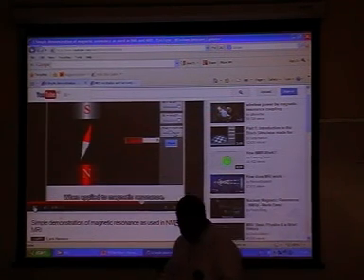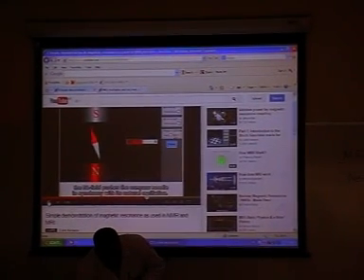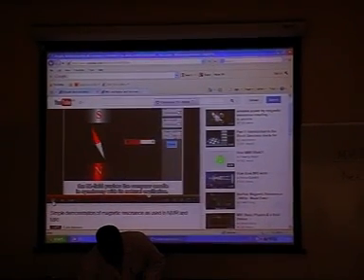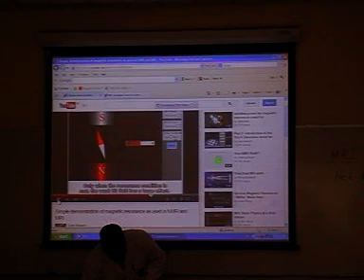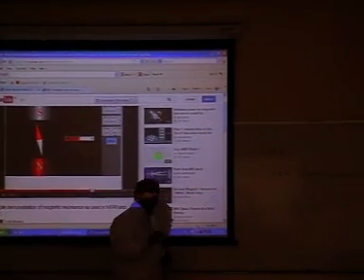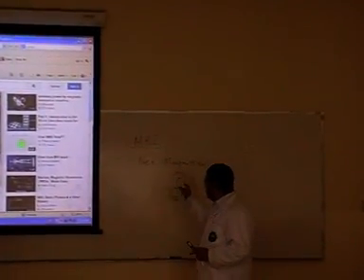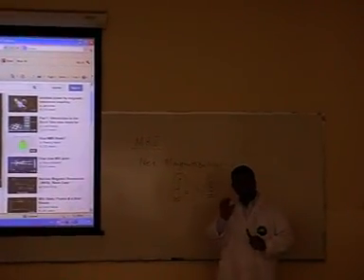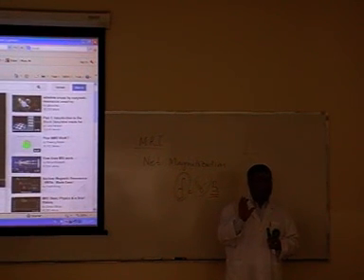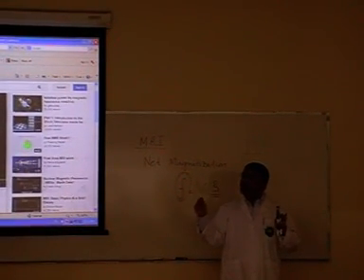When applied to magnetic resonance, the B1 field pushes the compass needle in synchrony with its natural oscillation. Only when the resonance condition is met, the weak B1 field has a large effect. So this is what resonance is, or the importance of resonance frequency. Once I find what the resonance frequency is, then I can set my RF to be at the same frequency.